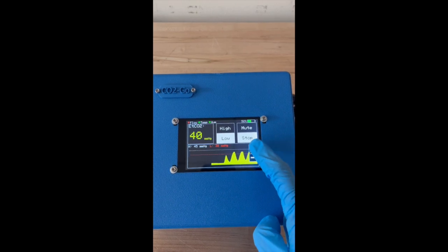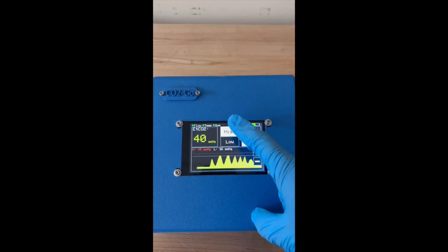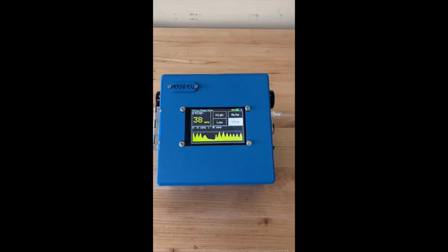thresholds for alarms by pressing the low button, pressing plus or minus depending on whether you want the millimeters of mercury to go up or down, and pressing the button simply again in order to set that as the value. High cannot go below the low threshold, and low cannot go above the high threshold.